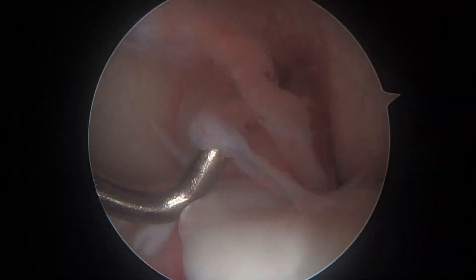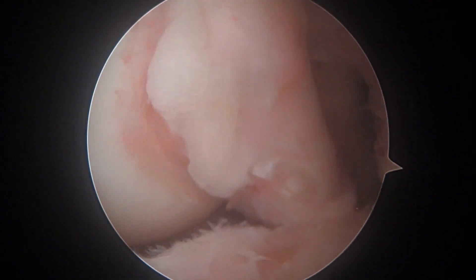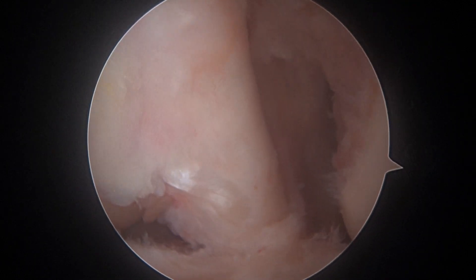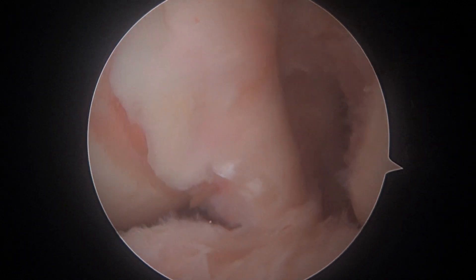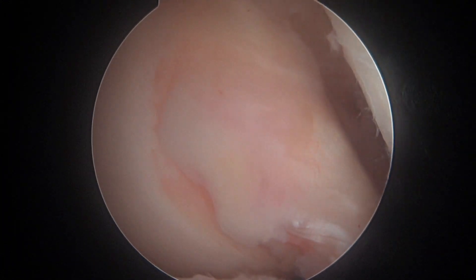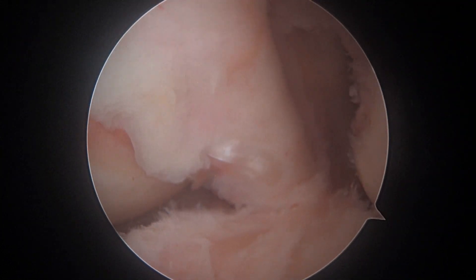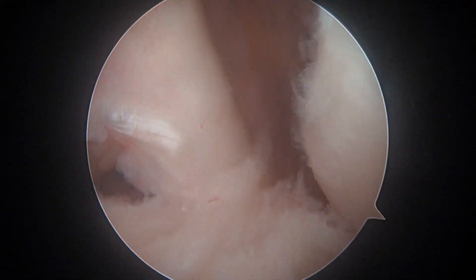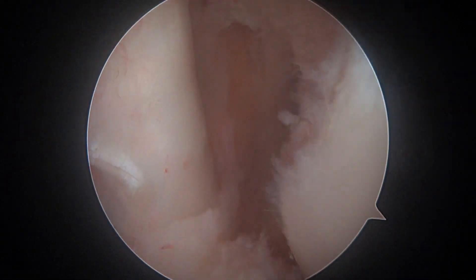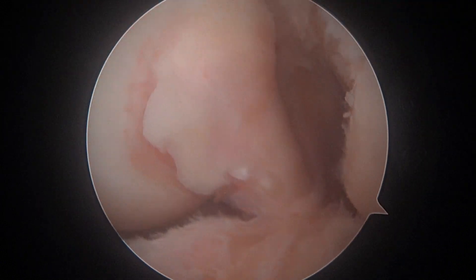Look at that right there — above that, this is part of the ligamentum. That's not the ACL, but this certainly was part of the ACL right there. So we're going to go ahead and clean this up. Now this area looks a lot different — this is the notch. That ligament you see there is the posterior cruciate ligament running up towards the medial aspect of the femoral condyle. The ACL used to be right here running up into the back, and that's where the new graft is going to go. That looks nice and open — we can put an 8-millimeter graft in there without too much trouble.